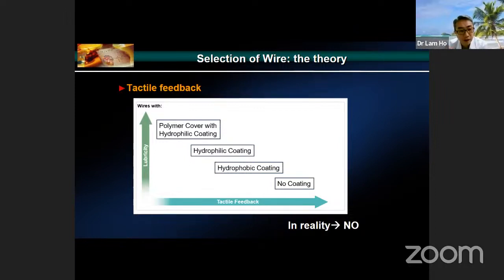For example, like Fielder XTA, I use it a lot, I have used it for many years, and I found that I can have very good tactile feedback for the wire that I'm familiar with. So this theory may not be true. I have heard from many great operators, they also had the same comment. They will have more tactile feedback with the wire that they like.